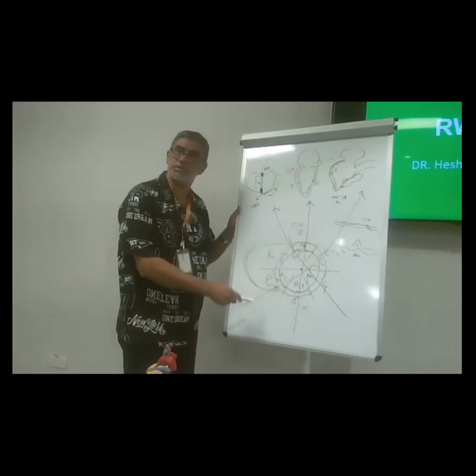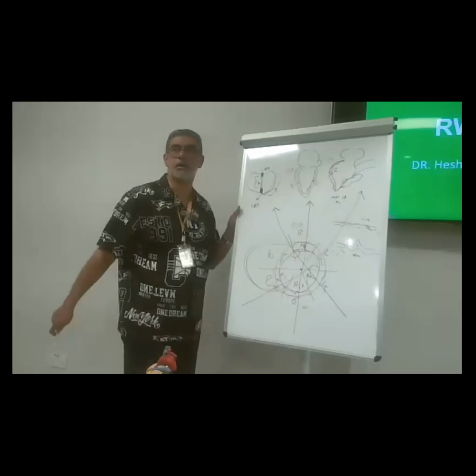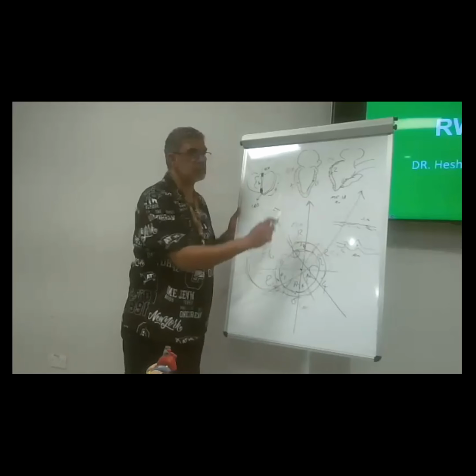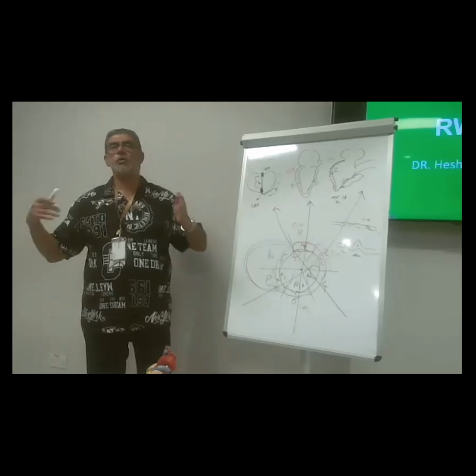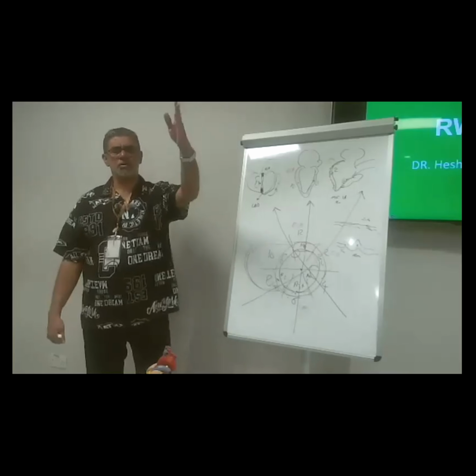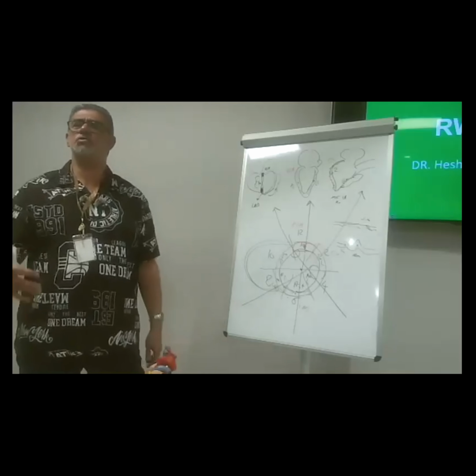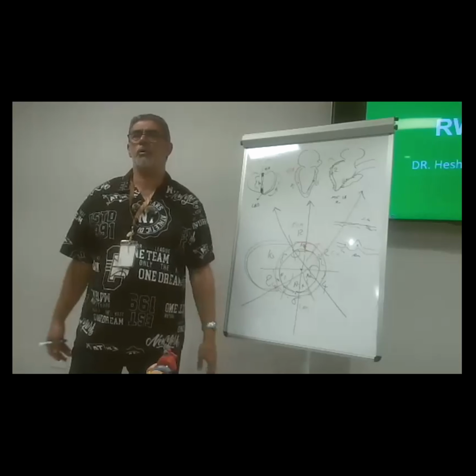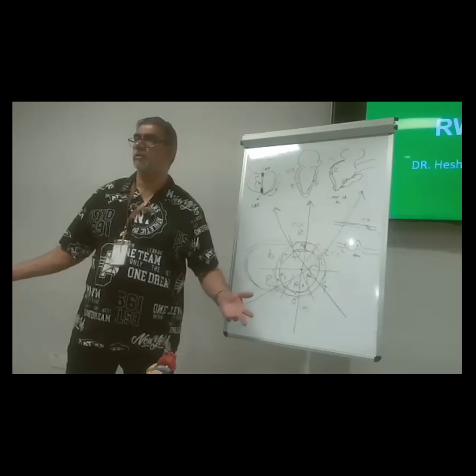You check the segments 2, 12, 6, 8. You find this 12 is again hypokinetic, and you confirm it here. You report it to the surgeon. The surgeon says, okay, this is air, it will be resolved. Just increase the pressure to allow the air to be absorbed.